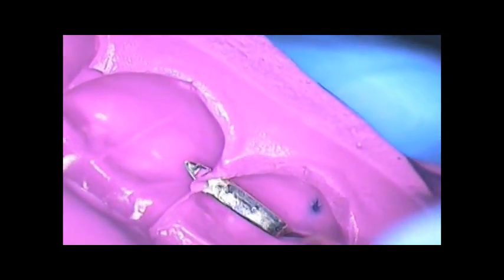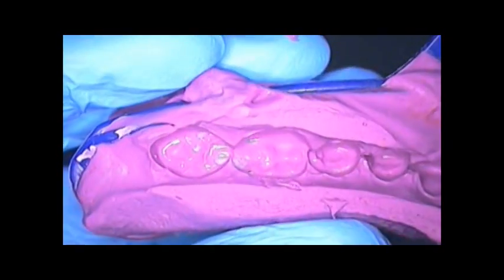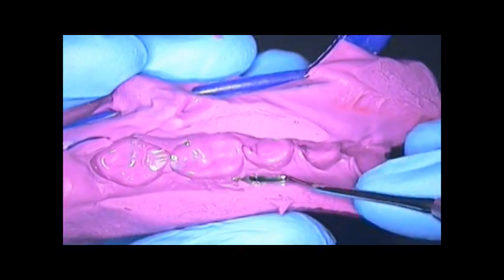I like to trim away a lot of the things that I feel are going to get in the way. So in the occlusal embrasure, I'll trim that. I'll come down, take out the buccal papilla. I'm using a Hollenbeck, I believe it's a half Hollenbeck. It has just a nice cutting edge to it. So I'm just removing the interdental papilla away from the alginate impression so that nothing will get in the way and it'll seat properly. I've had problems sometimes where, if I didn't trim away the interproximal areas, it would fold down onto the bite and change the bite, and I'd have to adjust. So I get in the habit of just doing that.